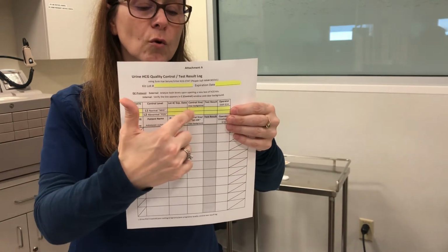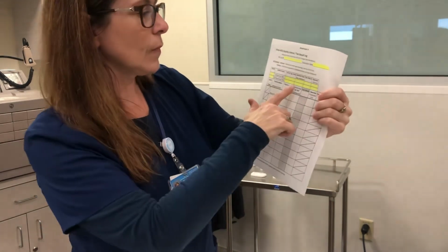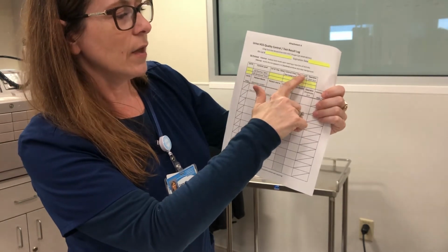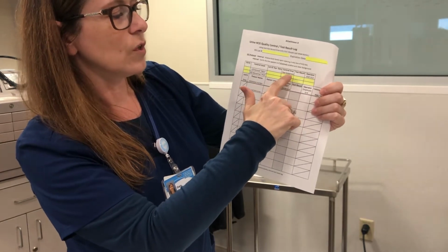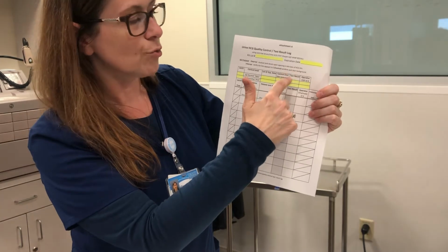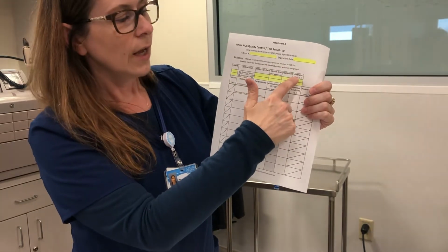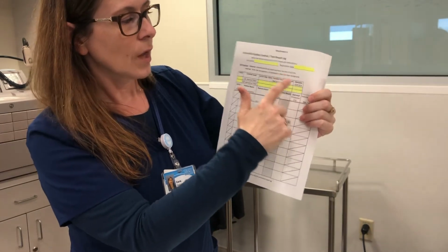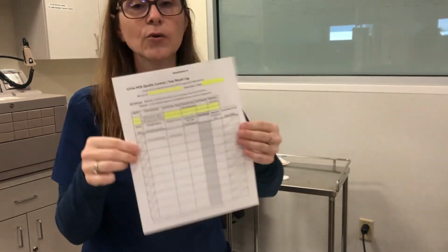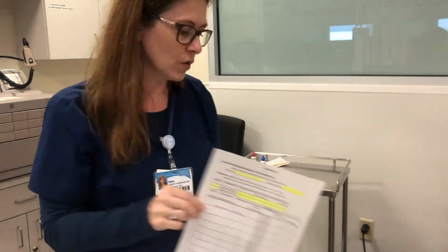Did you see a control line? It should say clear background control line. And then, it should say QC OK. QC OK is what's written there. Test result positive, POS, test result negative, NEG, and your employee ID. Also up top, what kit lot did you use and what is its expiration date? And now you're ready for the month to record those tests.